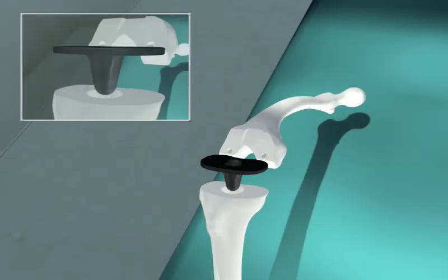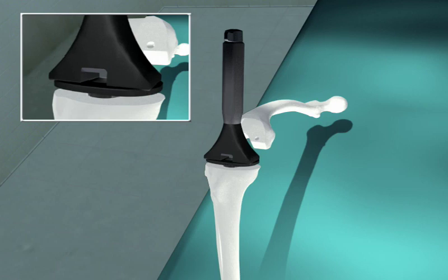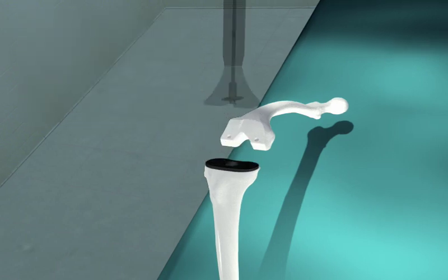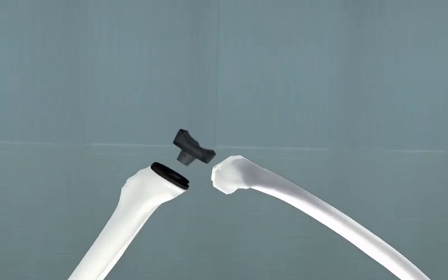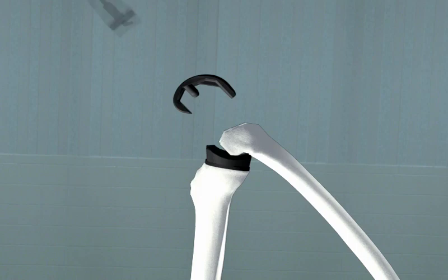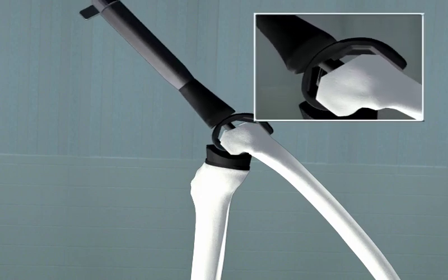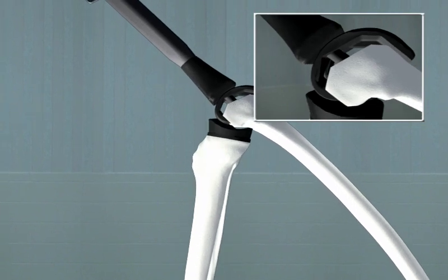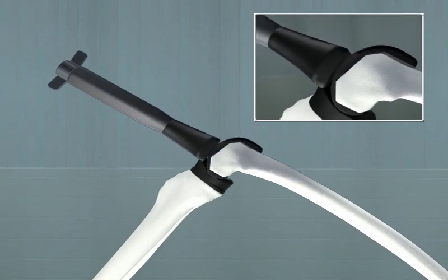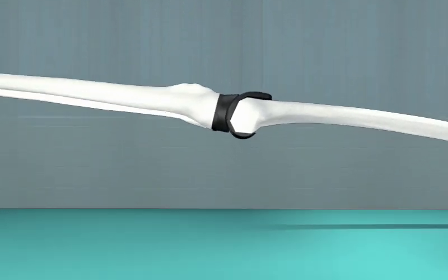Trial reduction begins with implantation of the properly selected tibial trial, then the rotating platform bearing, followed by installation of the correct size femoral component trial, initially impacted at 110 degrees of flexion and finally impacted in less than 90 degrees of flexion to prevent rocking of the tibial component.